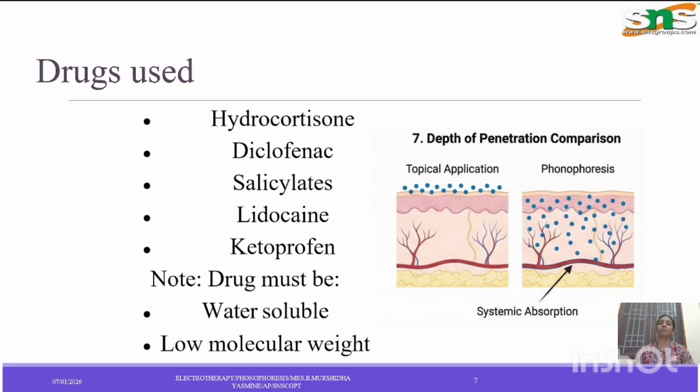The drugs commonly used in phonophoresis are hydrocortisone, diclofenac, which is a painkiller, an analgesic drug, and salicylate, lidocaine, and ketoprofen. These drugs are most commonly used in phonophoresis. The drugs must be water soluble and of low molecular weight. This should be taken into consideration while using phonophoresis.